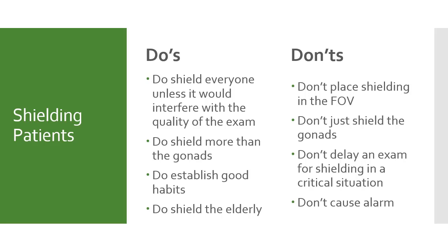Recently, it was stated through several different organizations that students should not shield for abdominopelvic exams. These would be exams such as the abdomen, pelvis, and hips. You will be learning more about this in your lab for your 102 class. Listed here are some common do's and don'ts of shielding.